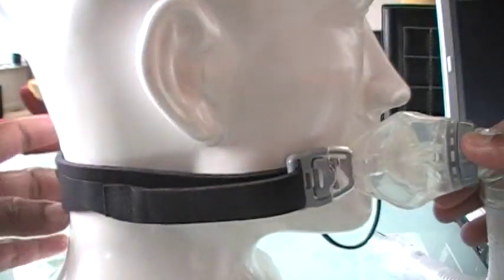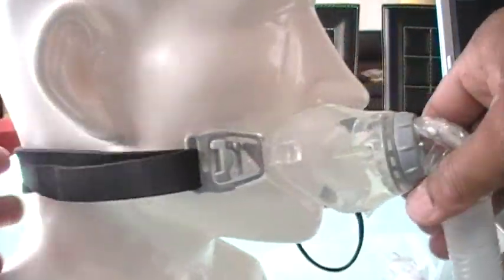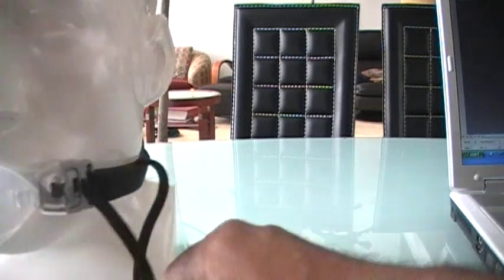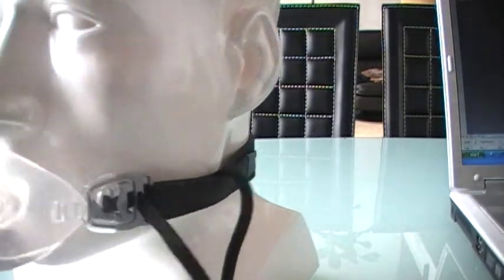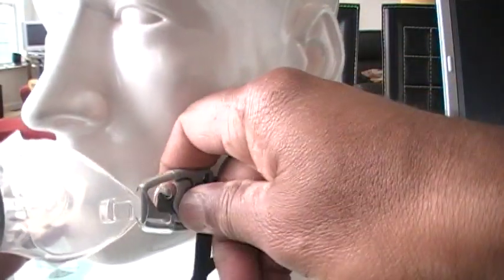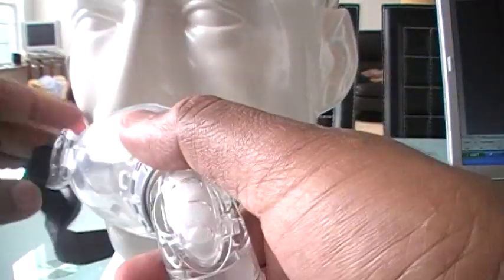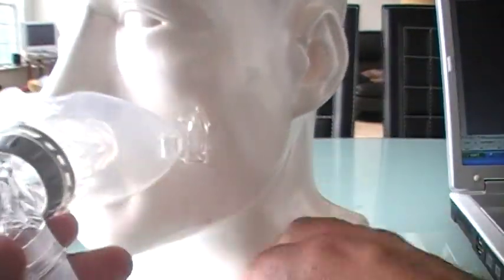Look at the head strap — it just goes up to here. It is absolutely refreshing to use a CPAP mask with headgear that just goes up to here. Let me tell you the beauty about this: every patient that I worked with on this actually does not use the headgear at all.